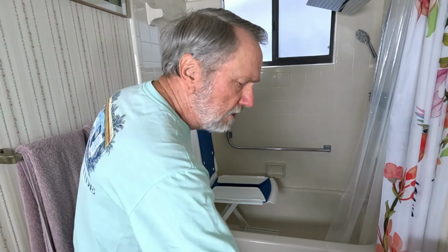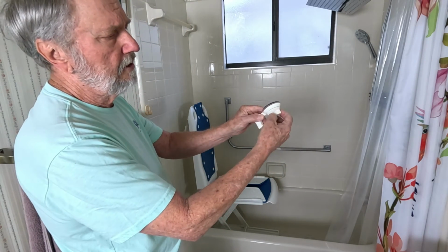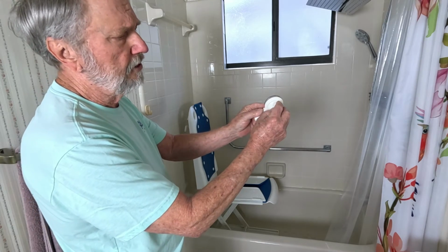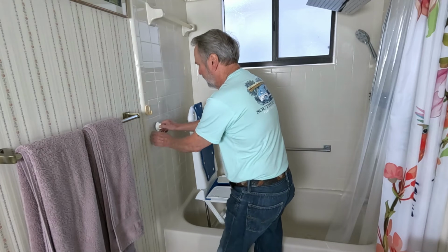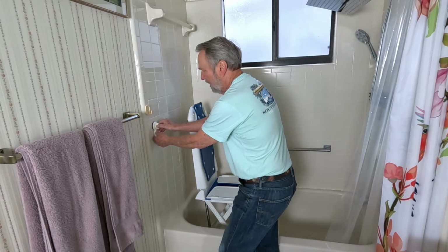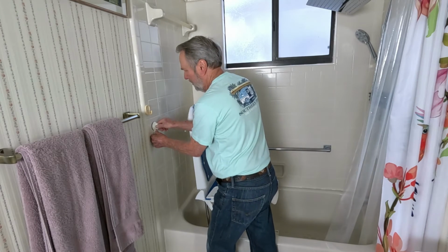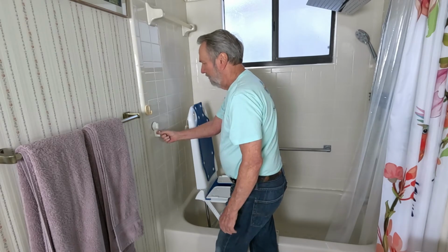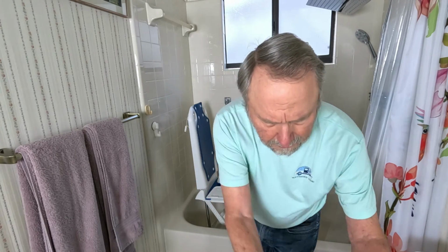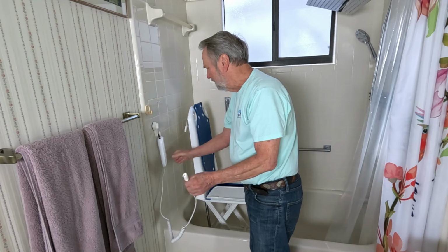All right, now we're going to show the mounting of this. You crank this all the way to the left, counterclockwise, and then we're going to put this right here, and not across a seam. This is going to hold. And we just wind this up until it stops. And right there is all we need. And now the remote control can hang right here.